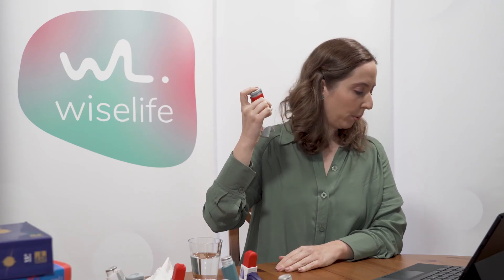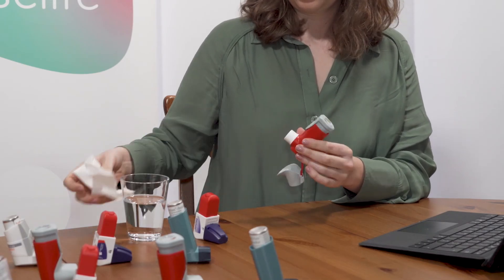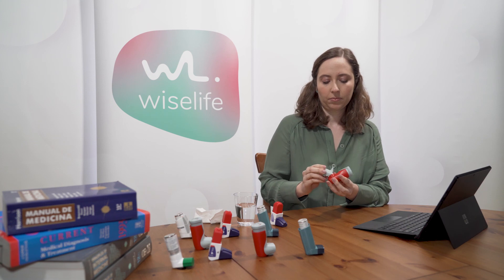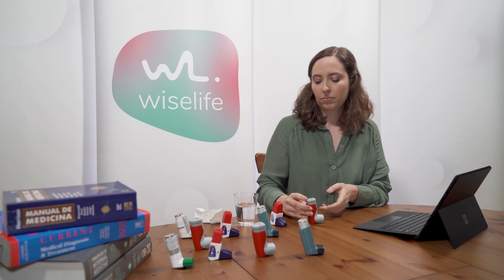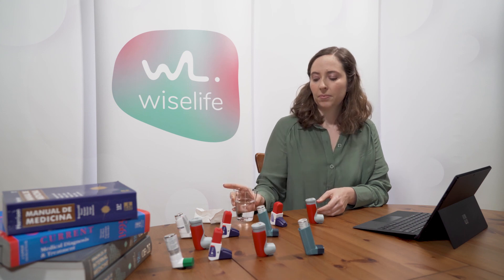Exhale slowly and gently. Clean the device with a dry cloth after each use. Rinse your mouth with water after using the inhaler and do not swallow.